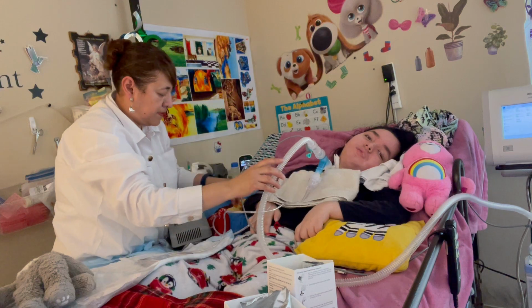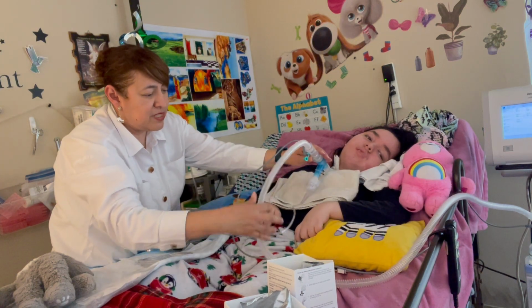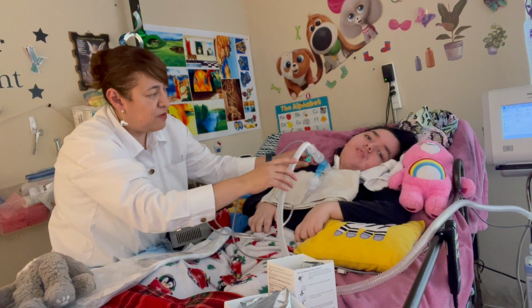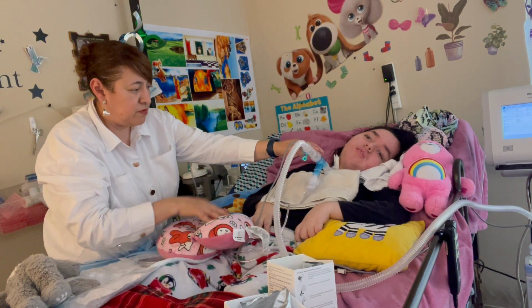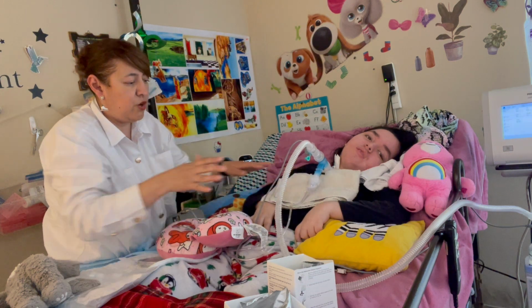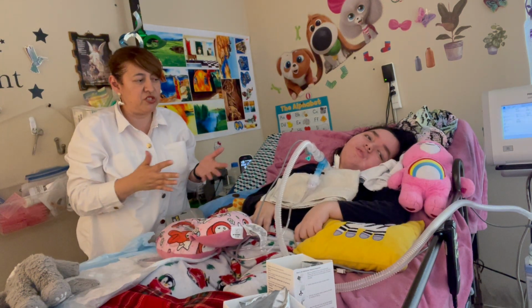Alright. That's basically what I do every single day, so she can breathe. And I just put a cushion here, so at home you can do different things to provide the help that every patient needs.